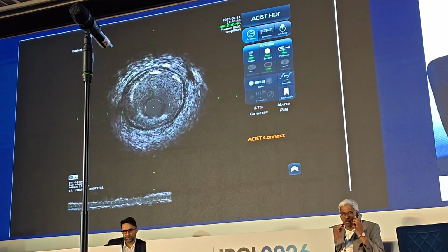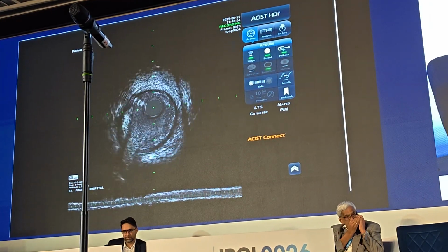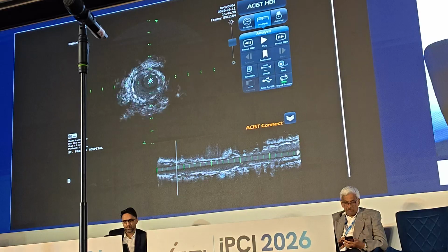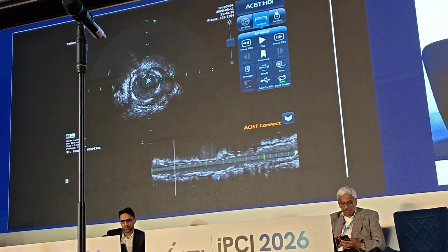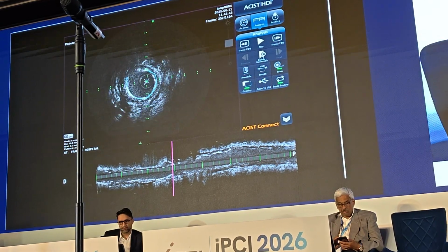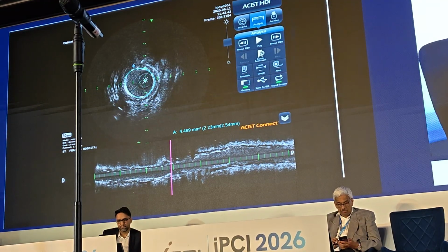I think you measured the minimal stent area previously, and then approximately no edge dissection. So let's see what it is now. No disease. You see it's significantly better. Coming out with IVUS. So we went from 3.1 to 4.5 or 4.4. So that's obviously a significant increase.